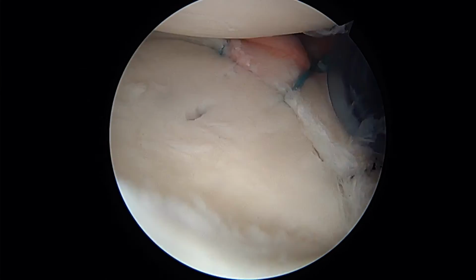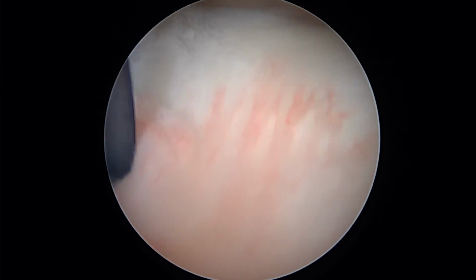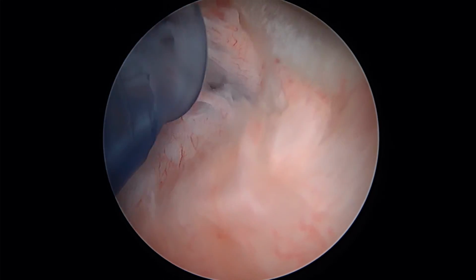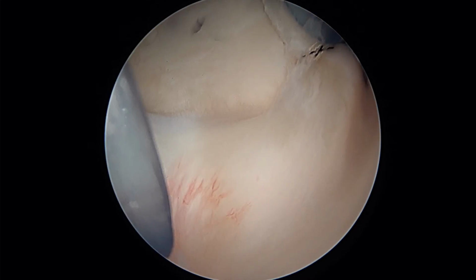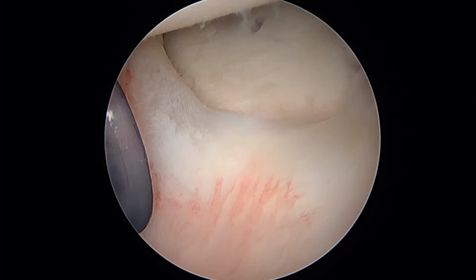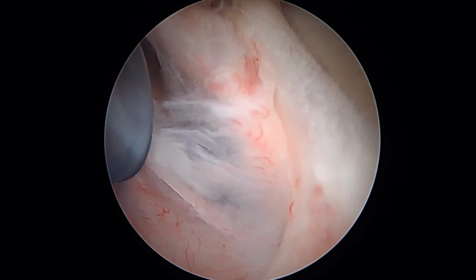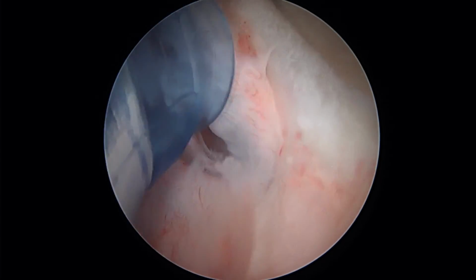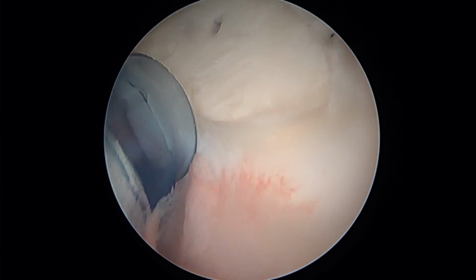Once again, that biceps tendon was just absent. It normally comes off just to the right of that blue cannula. And no signs of any trauma except the rest of the labrum, but where the biceps normally comes off, it's just missing. And there we can see the middle glenohumeral ligament coming down. So we're going to finish up here and get you back to the recovery room shortly.